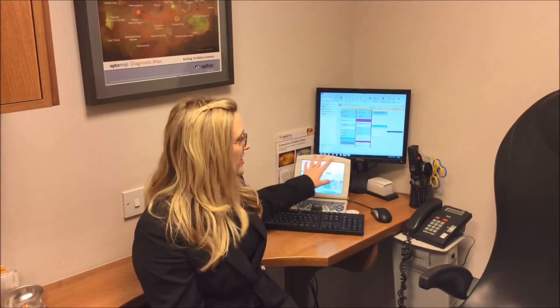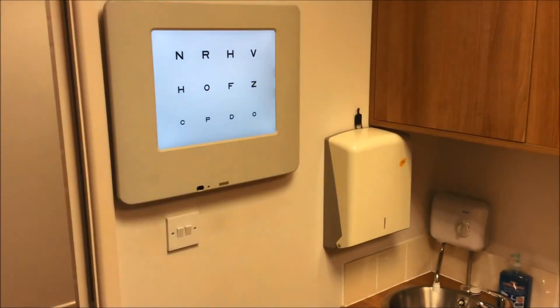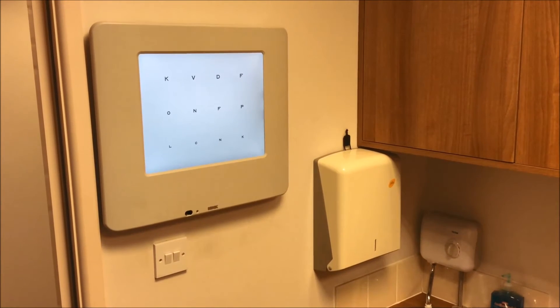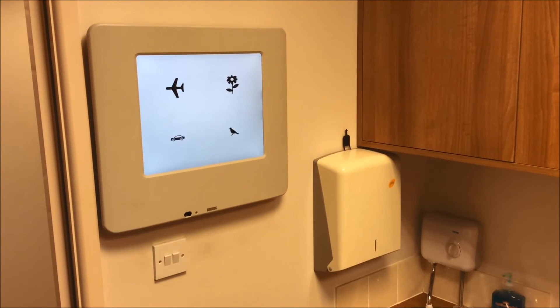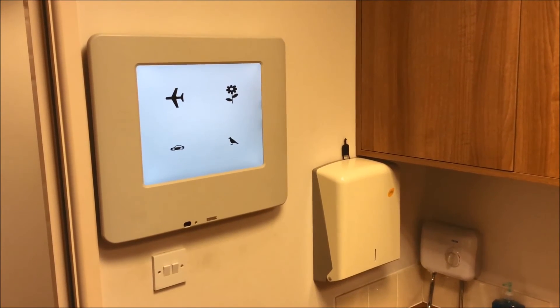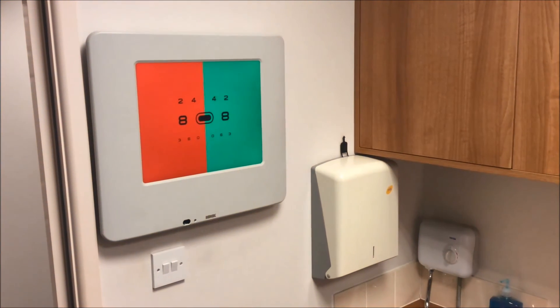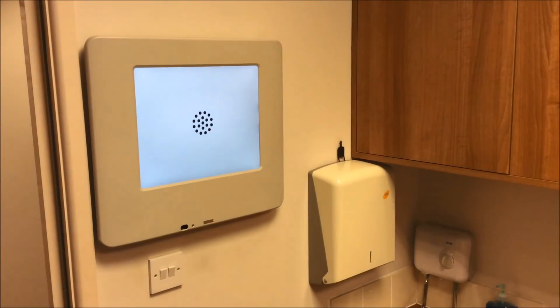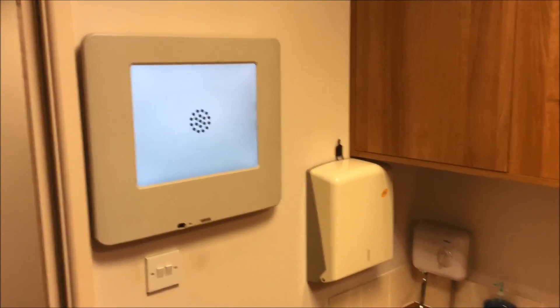So this gadget here is a controller which we use to change what you see on the monitor. It's got a variety of different sized letters, but it also has some more child friendly pictures for the children that don't yet know their alphabet. We also have on here the very familiar red and green for a lot of patients. And then there are also the classic circles which people are much more familiar with, and the question is: is it clearer with one or two?